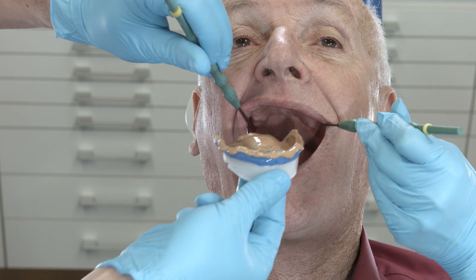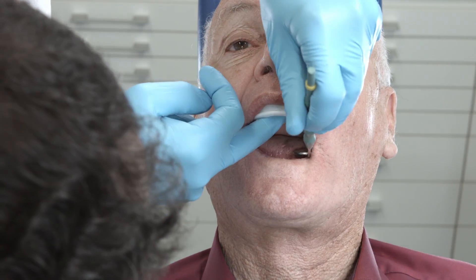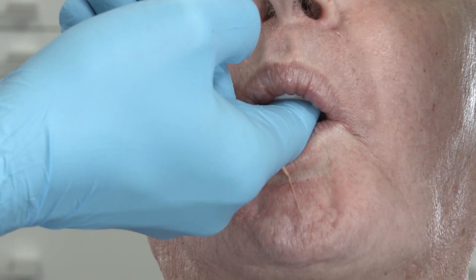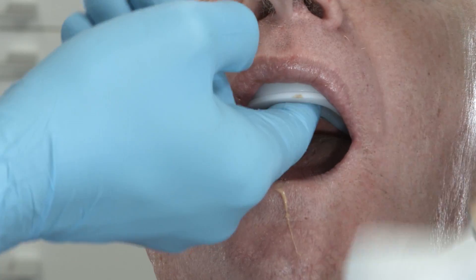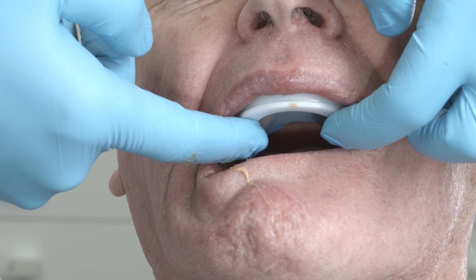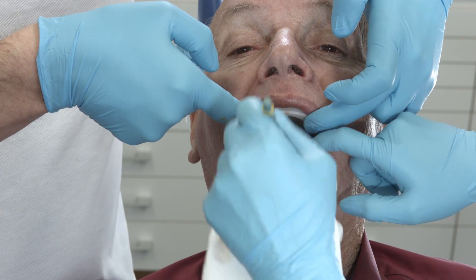Insert the tray and lightly press it into place. It is important to remove any excess that is pressed out on the dorsal aspect immediately. Ask the patient to suck on your finger again. This allows you to determine if impression material is still flowing towards the throat. If this is the case, remove it. The next steps are carried out in the same way as those for the impressioning of the functional margin.